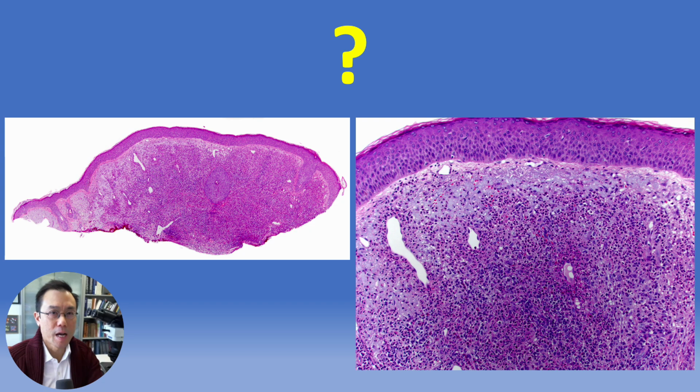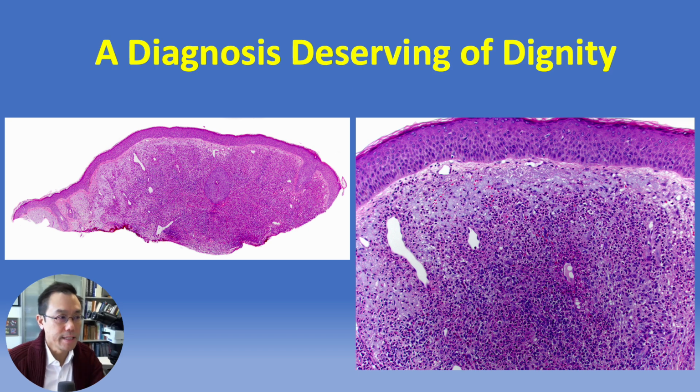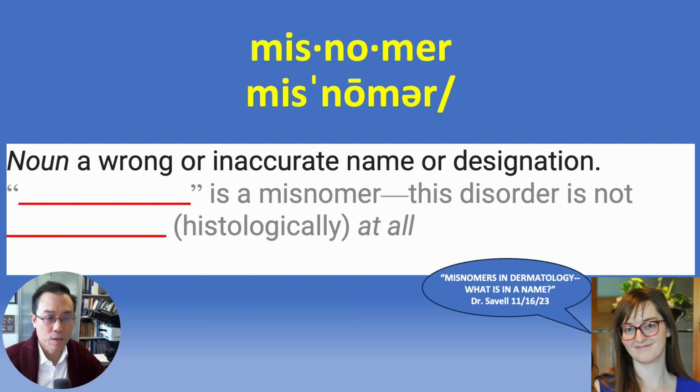Okay, on to a new topic, trainees, evaluate and interpret. Pausing for a moment, if needed, to evaluate these images whose diagnosis is deserving of dignity. And as a somewhat less esoteric hint, there is a misnomer involved.